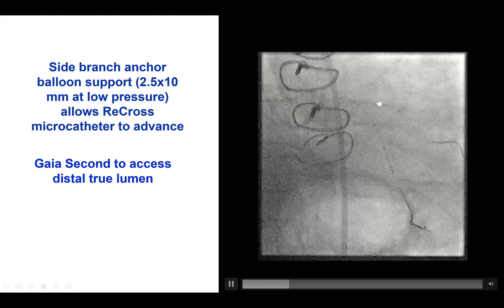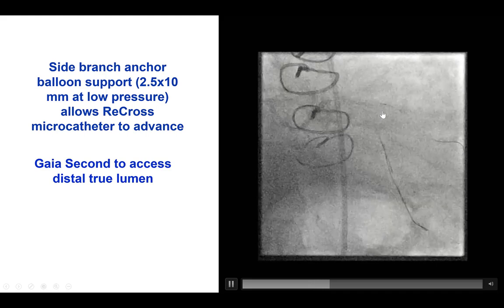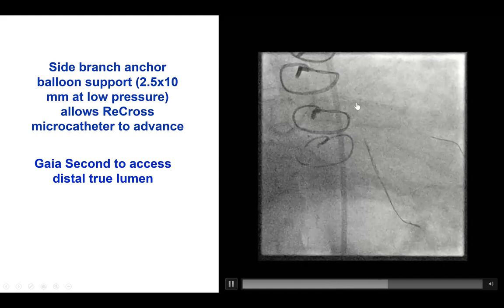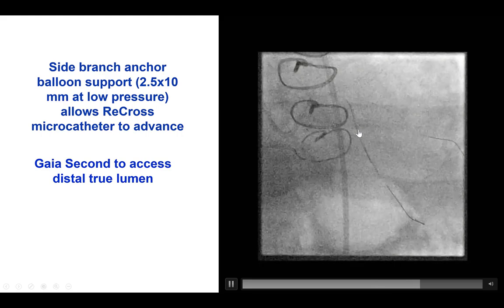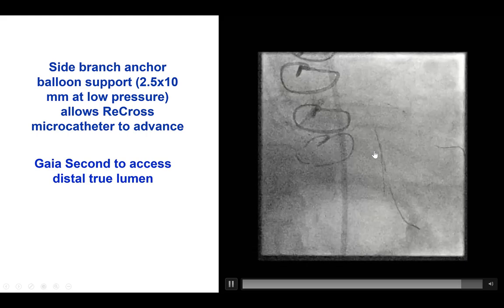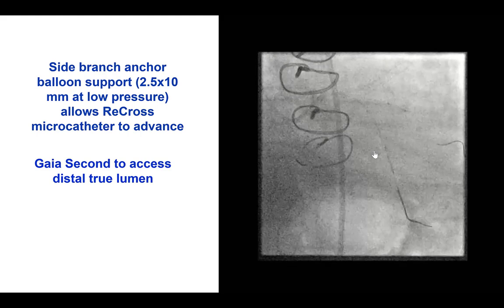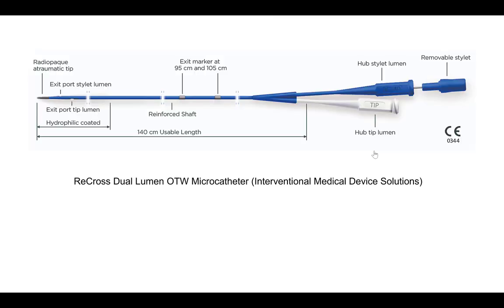We tried eventually the side branch anchor technique. This is a 2.5 balloon into the Ramus branch. After doing that, we were actually able to advance a Recross dual-lumen microcatheter past that area of occlusion. That was very helpful, because in this case, it was very unlikely to be able to deliver a Stingray balloon that has a higher crossing profile. Whereas the Recross was able to cross through this balloon-uncrossable lesion.